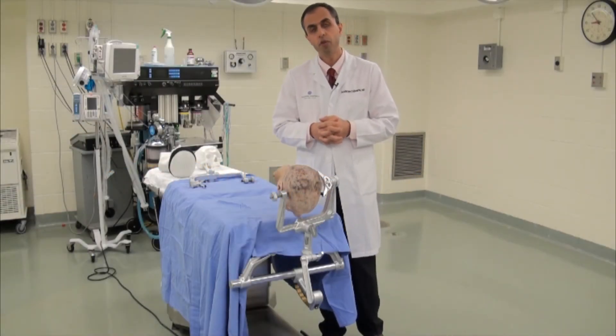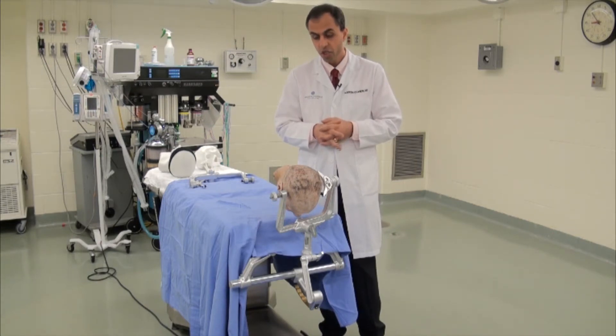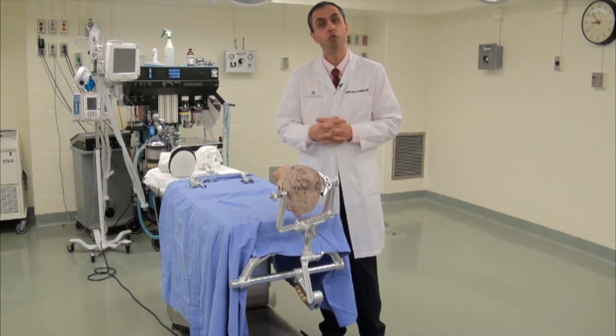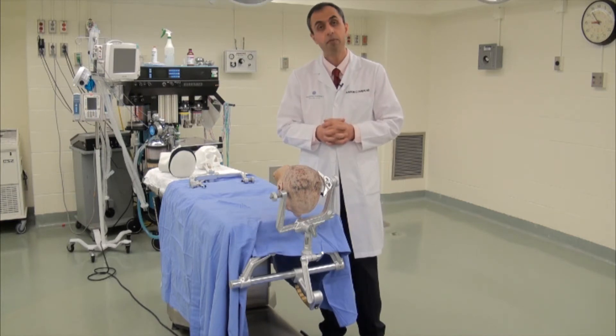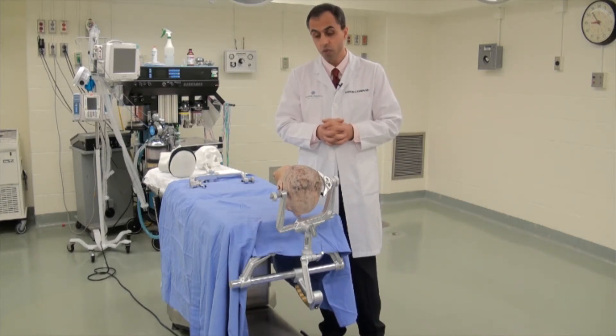For posterior cervical spine exposures, we have traditionally used a midline cervical incision. The patient is most often, if not always, placed in a simple prone position with the neck flexed. Obviously, significant flexion is avoided, and at least two finger-breadths are left between the chin and the chest to provide ample space for venous return.